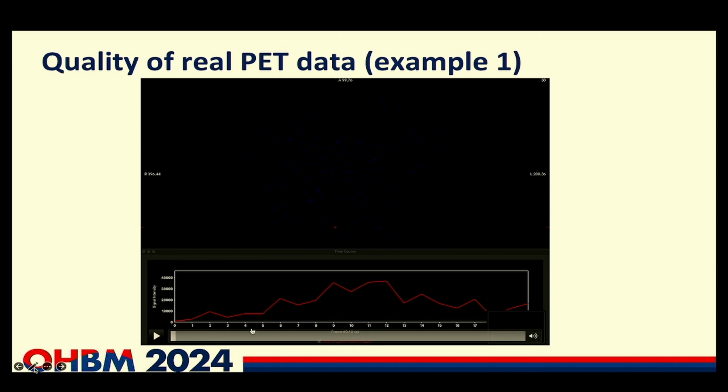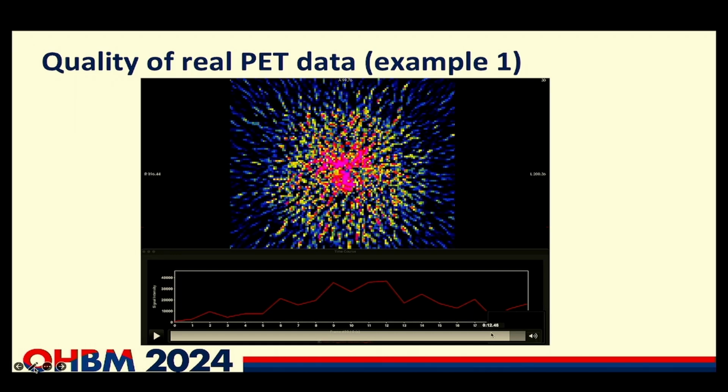And what you should also take away is that once we get to the end, depending on how long the subject is inside the scanner, you also lose a lot of information because the signal is decaying over time, you get washout of the brain. So you also lose some information here at the end, making this a very interesting problem, at least from a motion correction perspective, but also from a registration perspective in general.